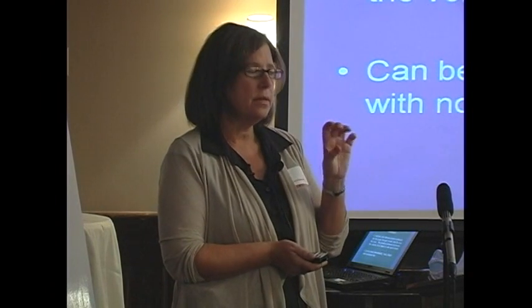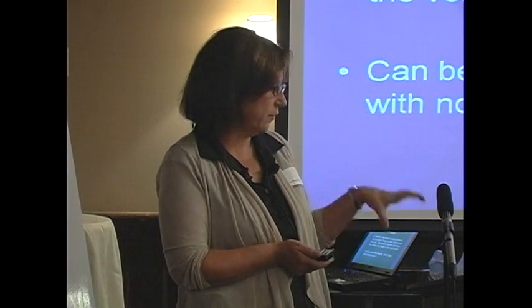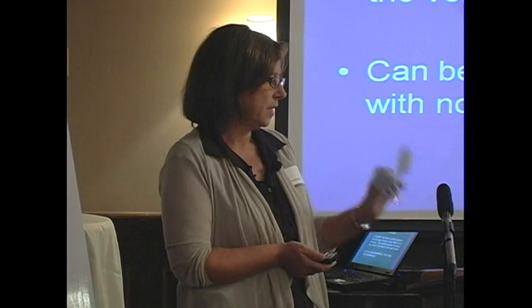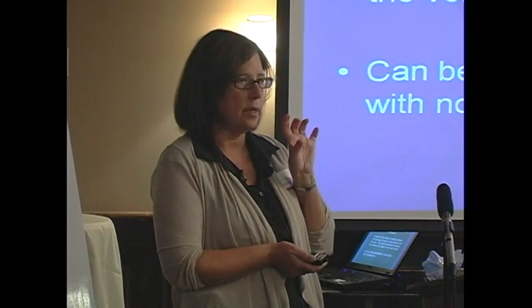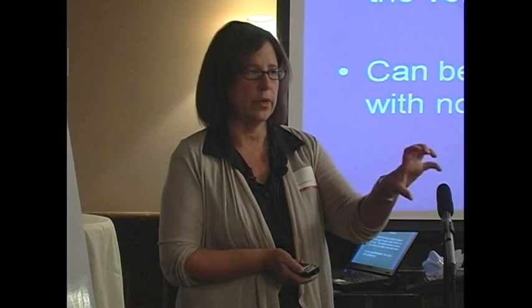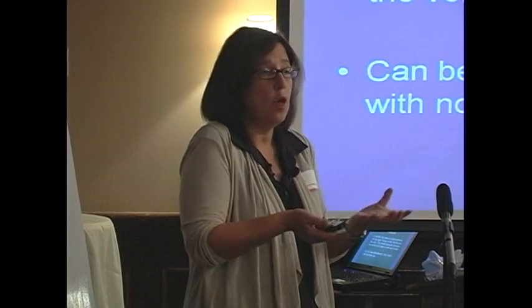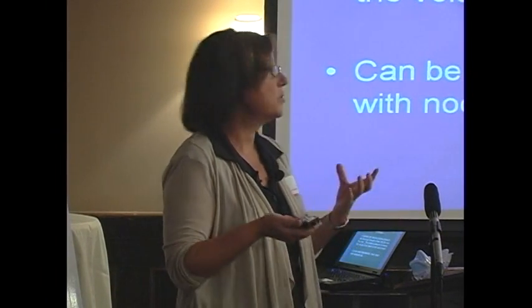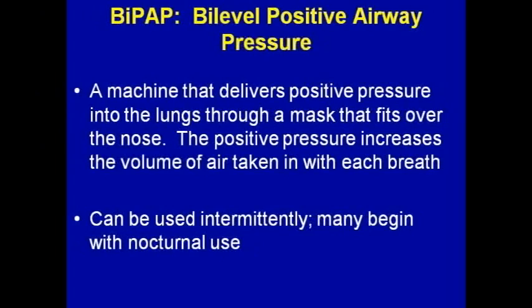The person initiates a breath, and then the machine gently delivers, through an interface, through a mask, a pressure that will then result in an increased amount of air being delivered into the lungs. That helps support the person's breathing. It doesn't breathe for them, but it helps support their breathing. So it increases the volume of air that the person takes into their lungs with each breath.